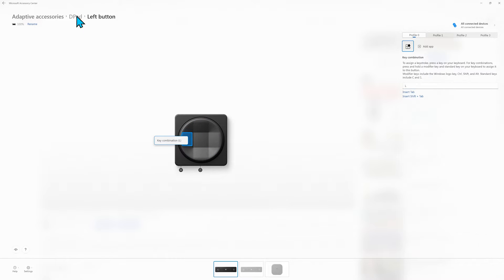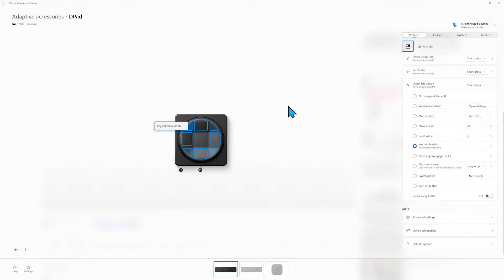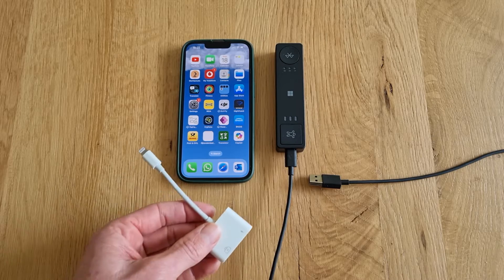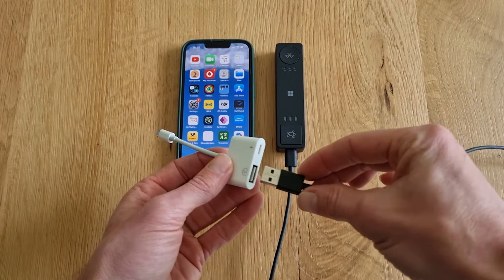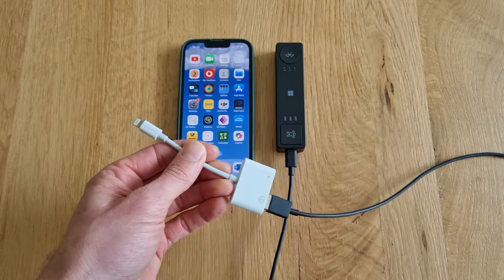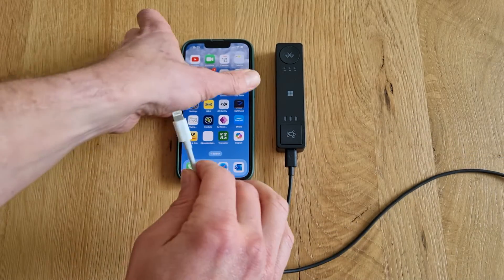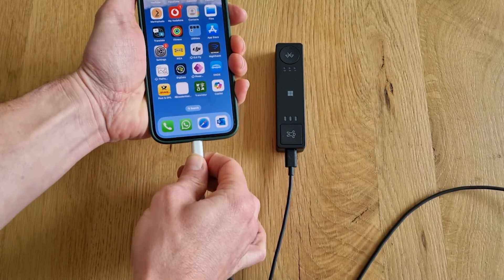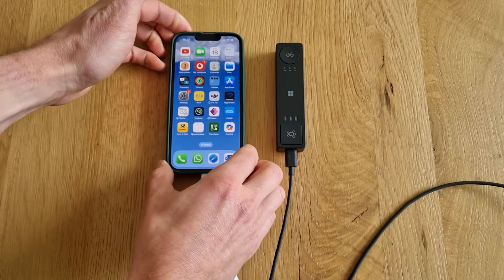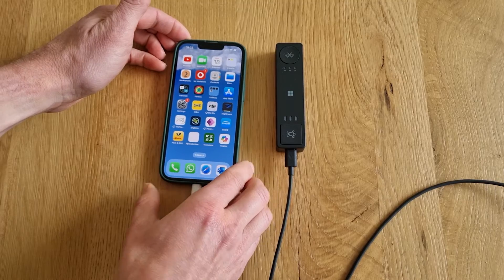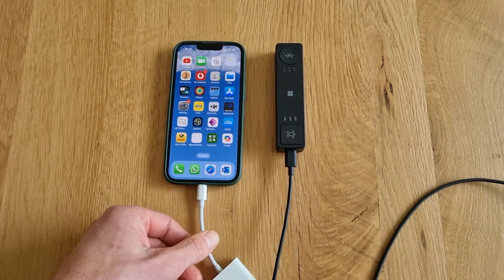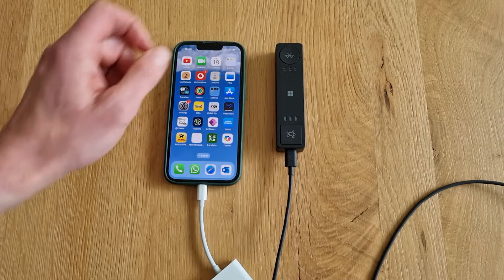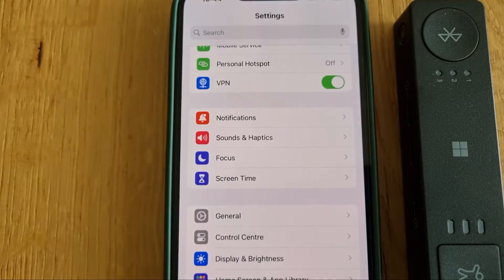Once you've configured everything you want to use, let's move over to the iPhone. To connect the Microsoft Adaptive Hub to the iPhone I'm using a USB-A to Lightning adapter. But if you have a newer iPhone or iPad model with USB-C, the standard USB-C to USB-C cable will do. For switch control on iOS, make sure not to connect over Bluetooth. You can however with Assistive Touch — check out our previous video for that.